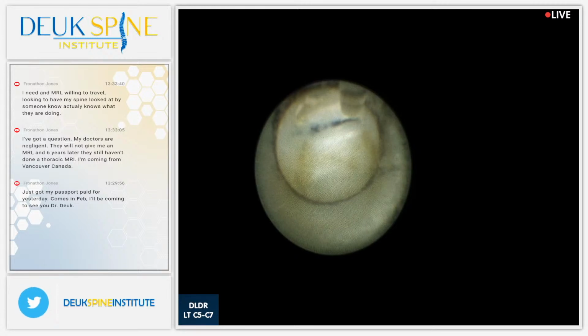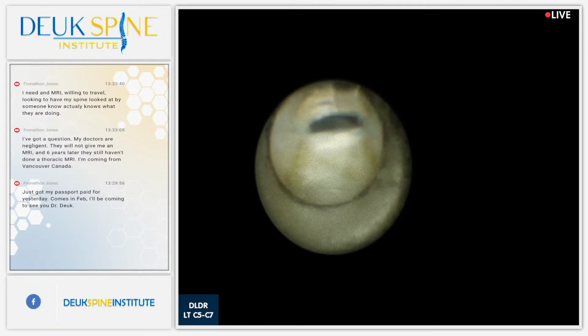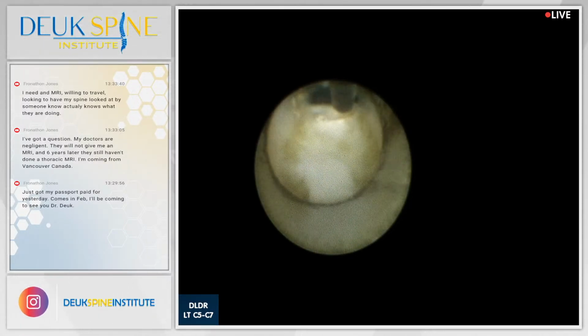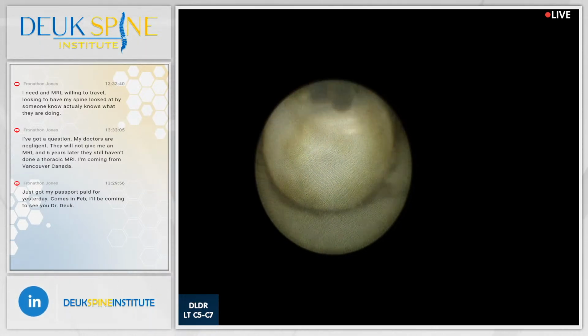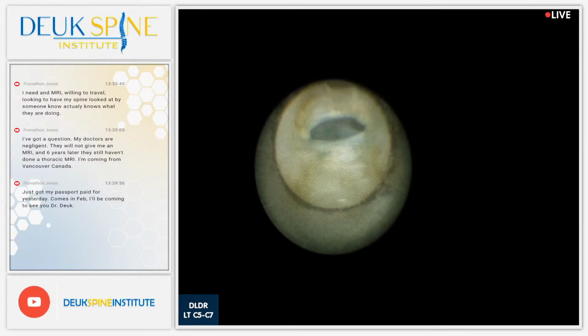By the way, that is a tear in the posterior ligament. And I'm going to see if there's any herniation back there. What's behind this is the spinal cord. There's a little gap right there, which tells me there could be some herniation stuck in there. And I do not want to leave herniation. But look at this. I'm peeling this away at 0.05 millimeters per pulse. That is as precise as it gets, folks.